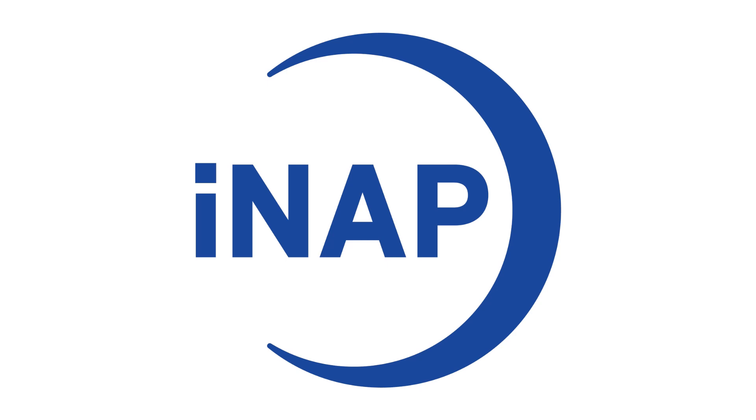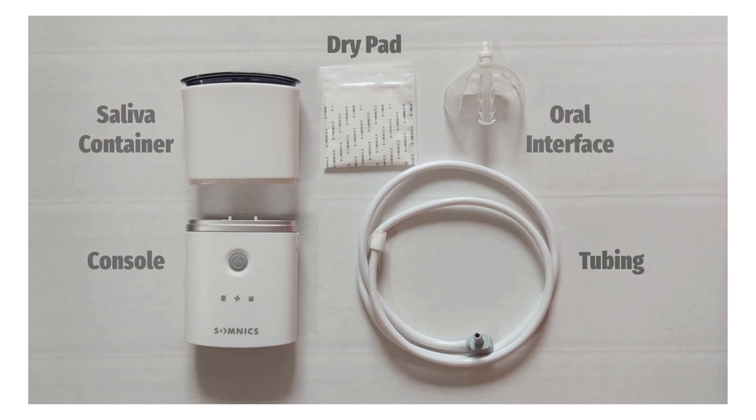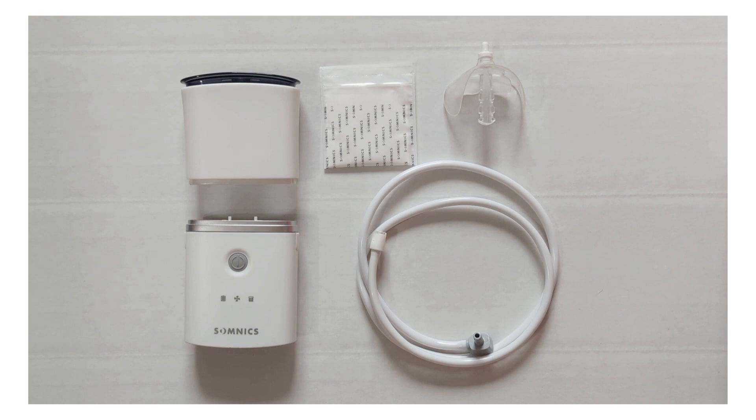In this video, we will go over the assembly and powering on and off of your iNAP device. Once you have unpacked all of your items, you will see that you have a console, saliva container, dry pad, tubing, and oral interface.